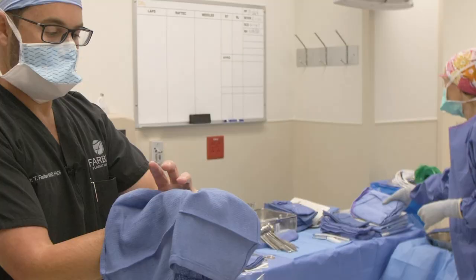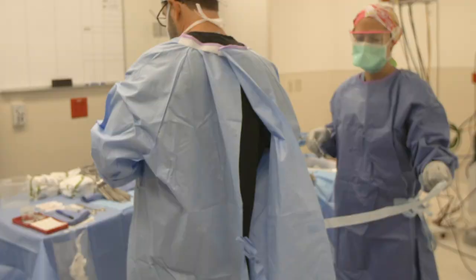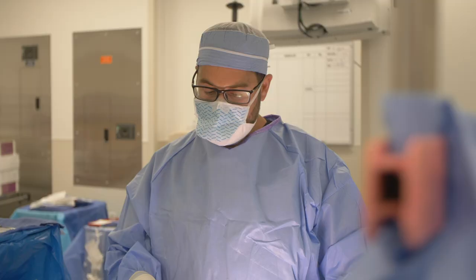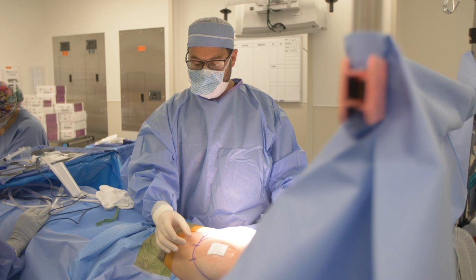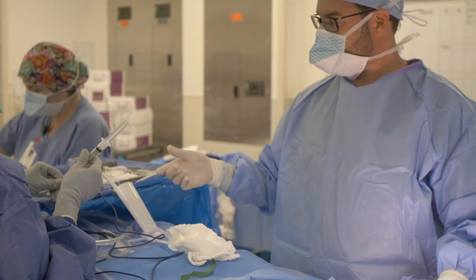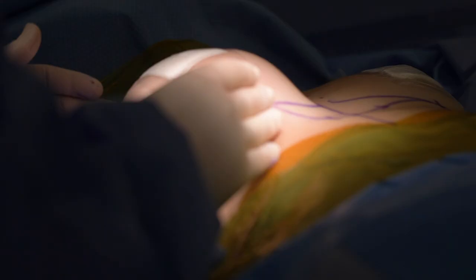We're here in the operating room — this is where we're all set up with the instruments for everything we're going to be doing. The patient has been prepped and draped sterilely. We've covered up her nipple and areolar complex for privacy and modesty. We've made our markings preoperatively to denote her inframammary folds and inframammary incisions; we also noted that her left inframammary fold was a little bit higher than the right. We've marked the borders of the medial aspects of the breast. Now we're going to start by injecting a little bit of local anesthesia to make her more comfortable post-operatively, and then we're about to make the incision and put a silicone sizer in to really see how our pocket is shaped.